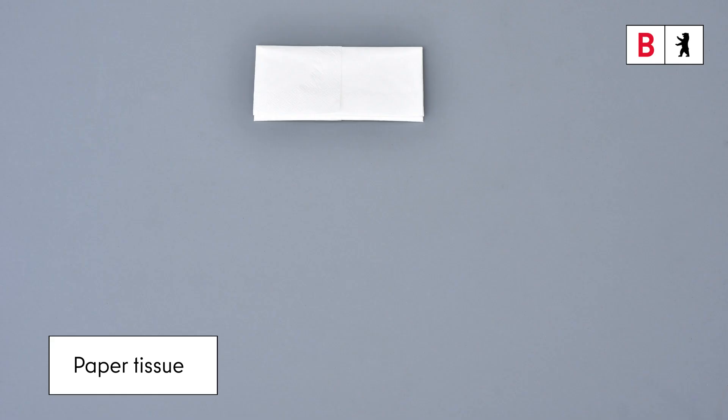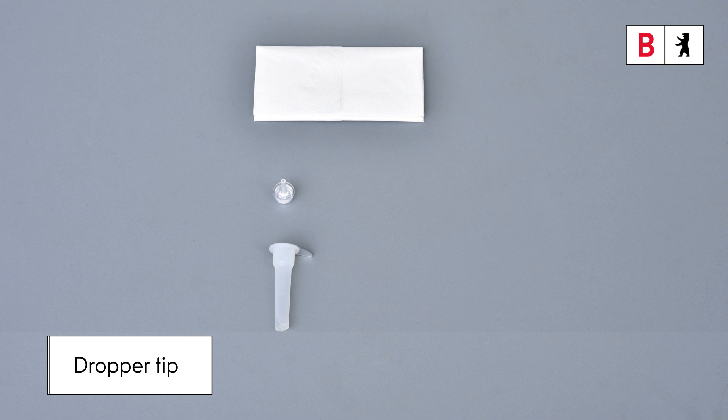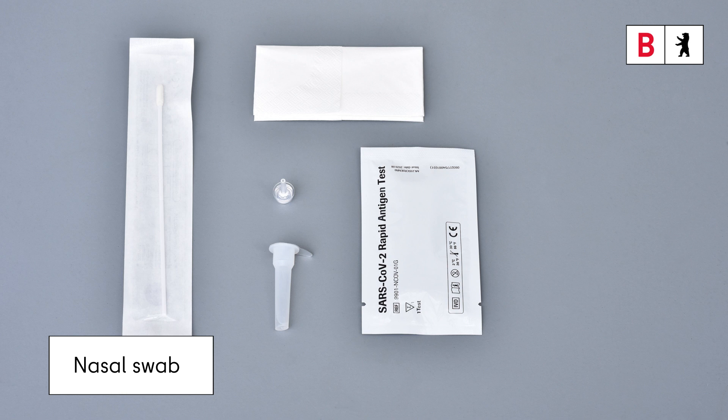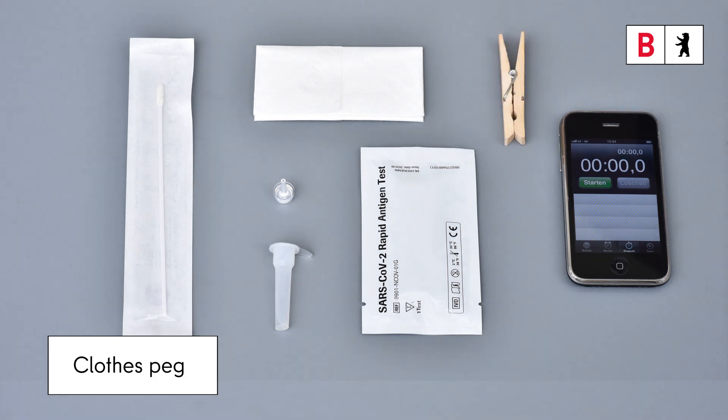You'll need these: a paper tissue, the tube with a buffer solution, the dropper tip, the test cassette, the sterile nasal swab (that's the stick for the nose), a timer or a phone with stopwatch, and, if available, a holder for the tube, a clothes peg, or a stand to put the tube in.